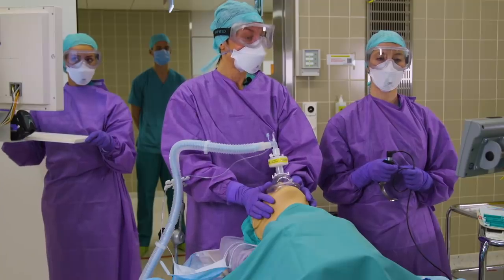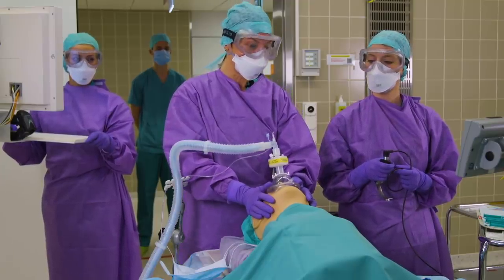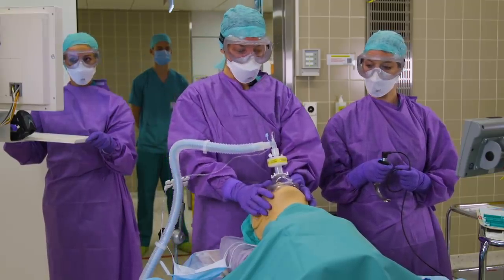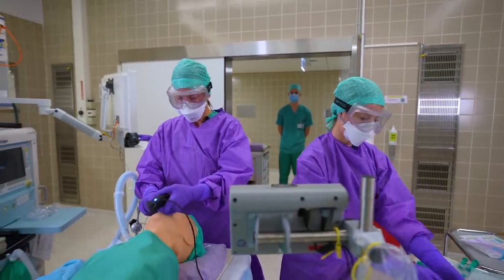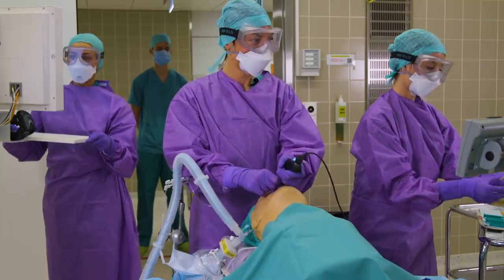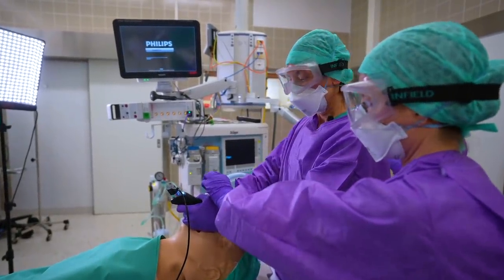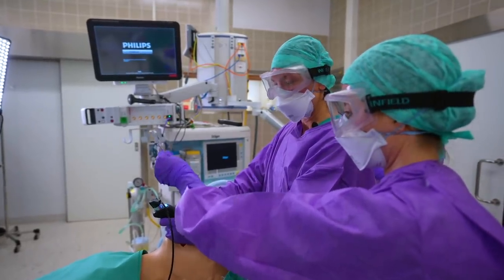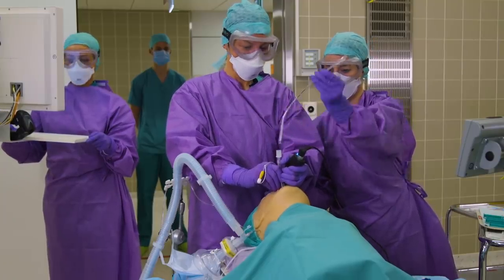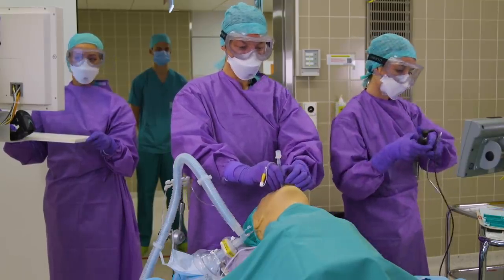Avoiding coughing with thorough relaxation is also of utmost importance. We induce the patient, and our patient is paralyzed. We are now intubating the patient with a video laryngoscope, utilizing an endotracheal tube with a stylet in place. The endotracheal tube is now in place and the stylet can go. It's important to inflate the cuff before ventilating the patient.